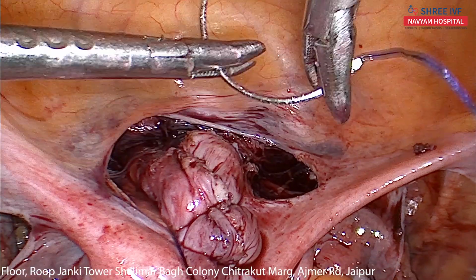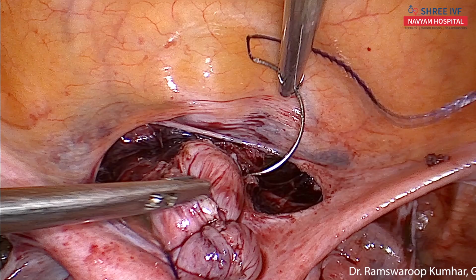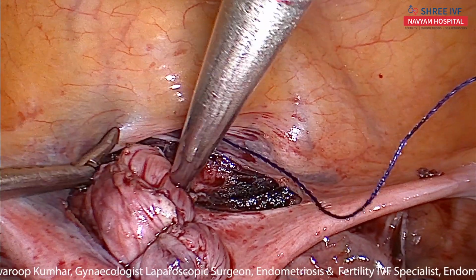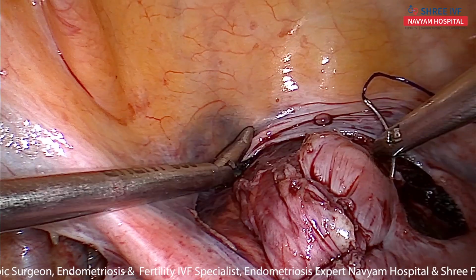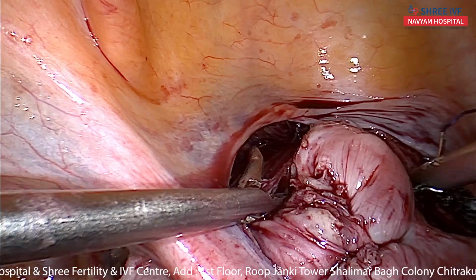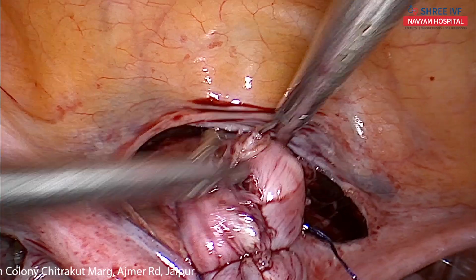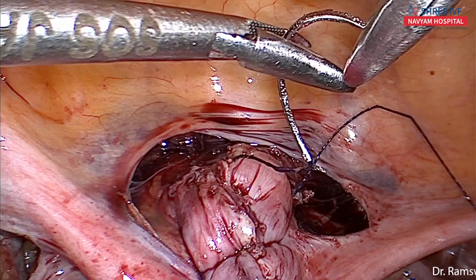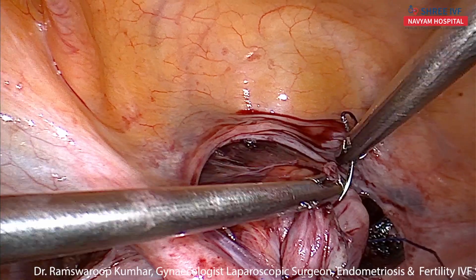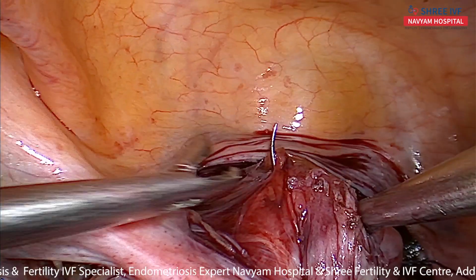Half of the myomas we have removed out, and the same number are remaining on the posterior side as well. And my needle is going very deep. So I'm taking one by one. This side, the deeper part, bladder should be away.